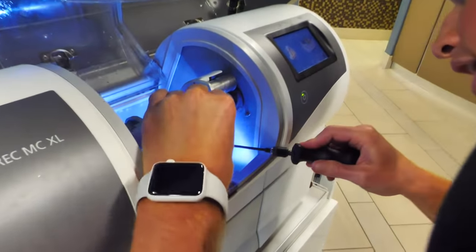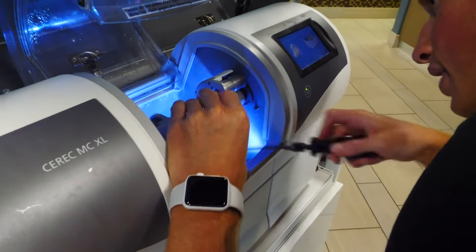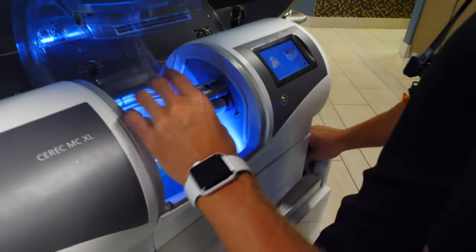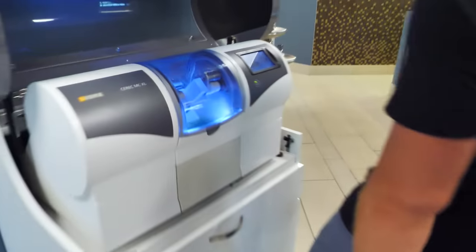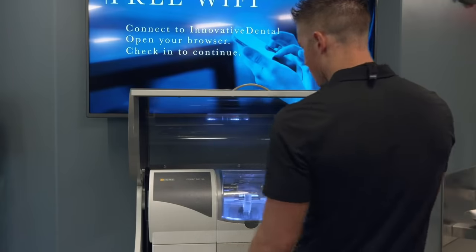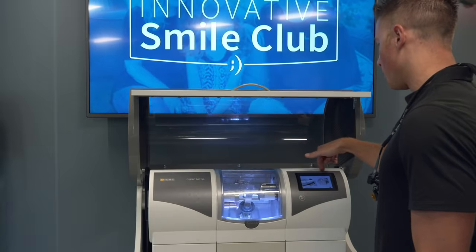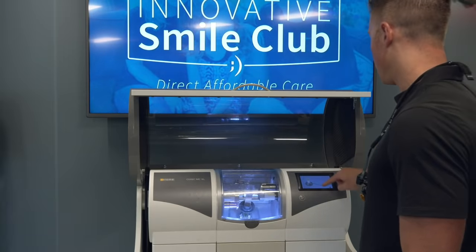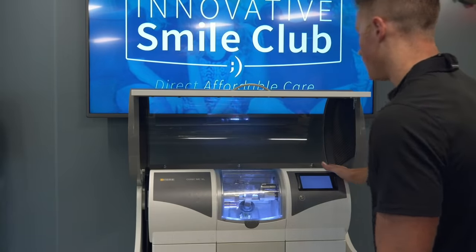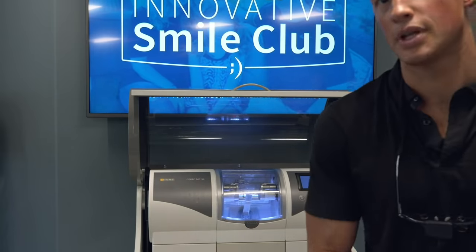So you all are gonna have to give me some questions, because 35 minutes is gonna be a long time for me to talk about implants. I'll give you my spiel on why guided implants, other than accuracy, here in a minute. But now you can see on this software, it's gonna load it. And then the image you'll see here pull up on this screen will be the guide itself, so that's kind of cool. You can see on the screen there, Michael.